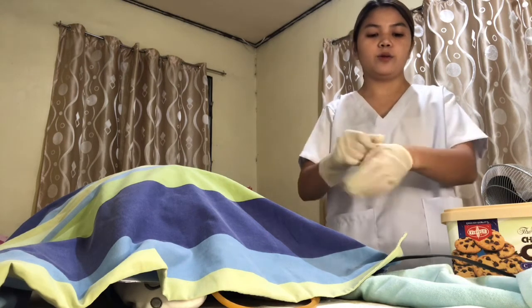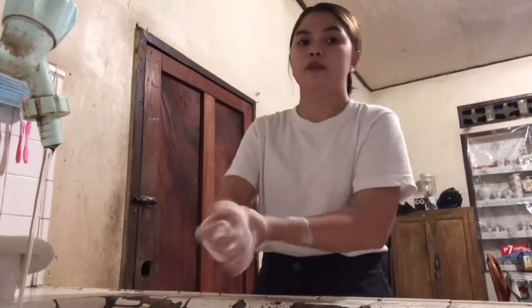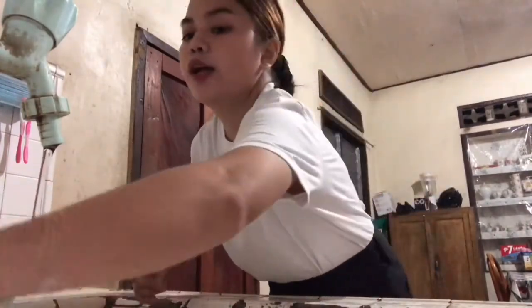So next, we will remove our gloves and discard them. And after that, we will do hand washing. This prevents the spread of microorganisms. So after that, record the time of the procedure done, and observe the character, amount, and color of the initial urine output in the drainage system. So this is to determine if urine is flowing. So we will just record everything.